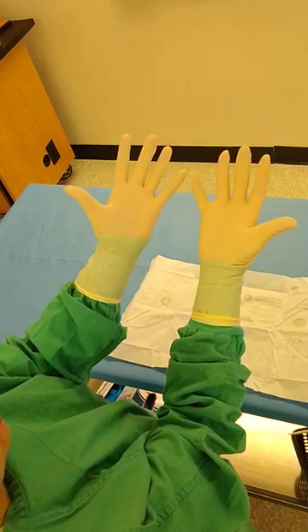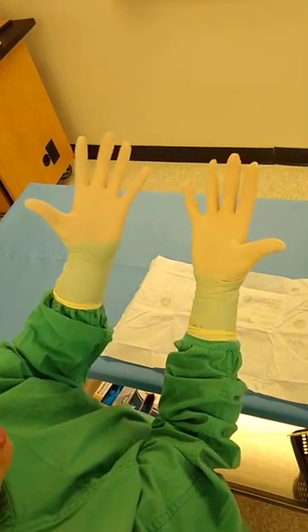You can adjust, but you want to keep your cuff inside your glove. If you accidentally pull your cuff out, you have to start over. If you rip your gloves, you have to start over as well.